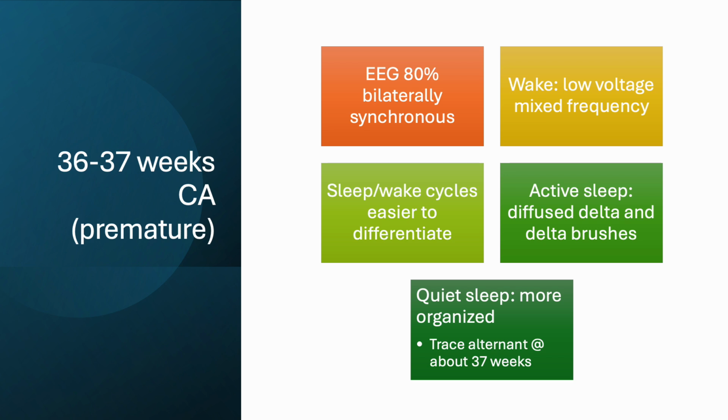This is really the same as low amplitude, but LVMF. We're using different terminology for infants because they do have different brain processes than a normally developed brain does, and we should attempt to differentiate the two.